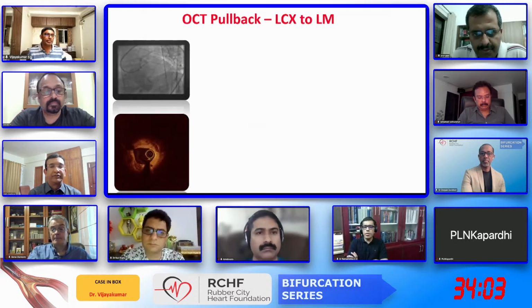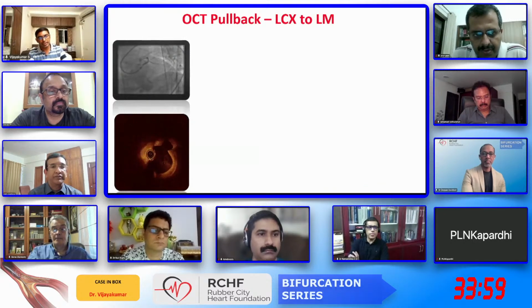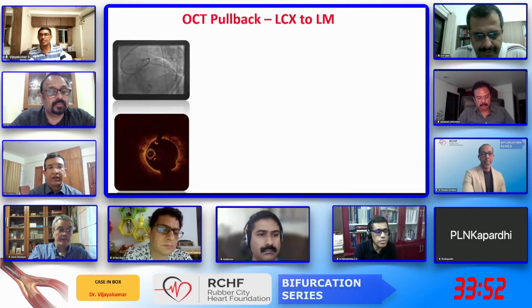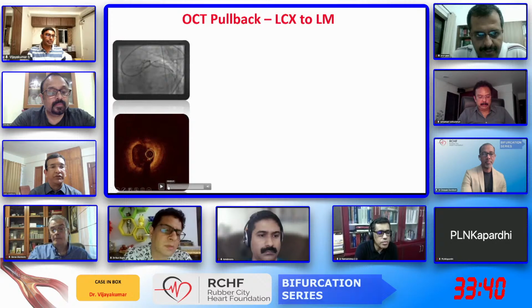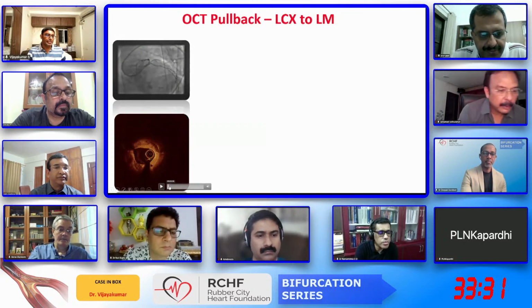Okay, I'll move forward. So we did OCT imaging from LCX to left main. Can you people see the OCT imaging? Yes, as a small screen, not on the big one. Maybe I'll just show you still images, but if anybody wants to make comments, I'll replay it. I'll go slowly. This is from the mid part. You can appreciate there's a lot of calcium, right? Yeah, a lot of calcium. But it's not very thick in places, so we just went through it.